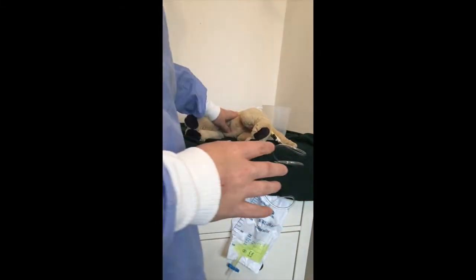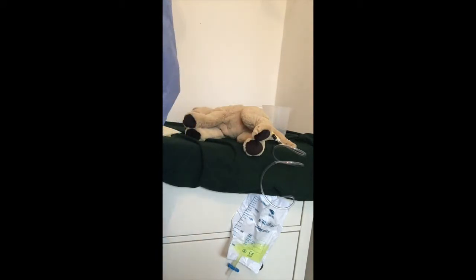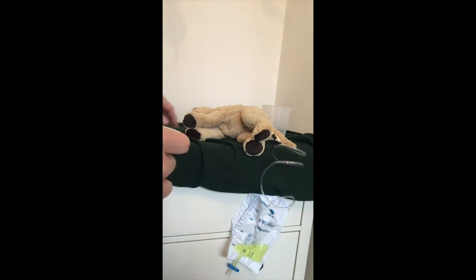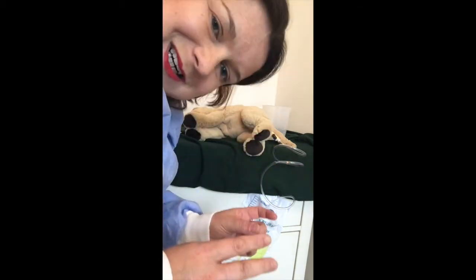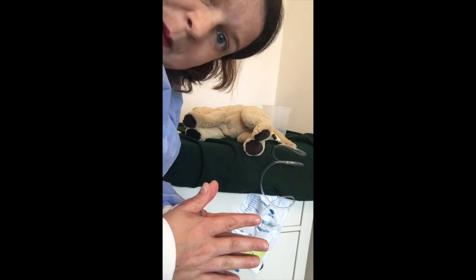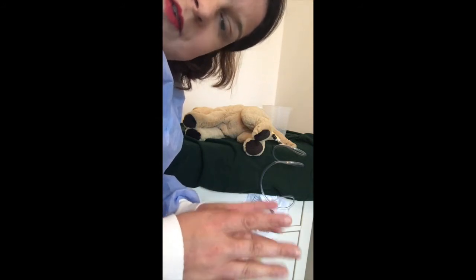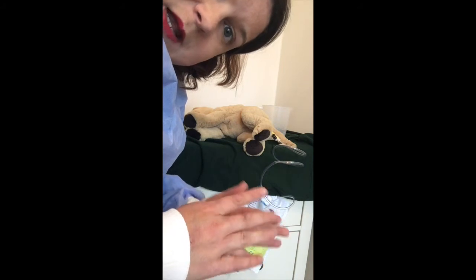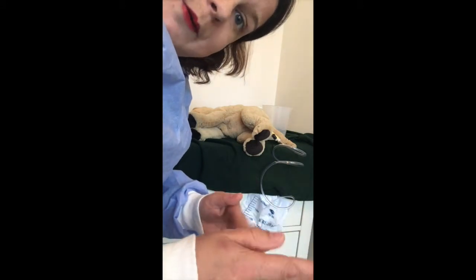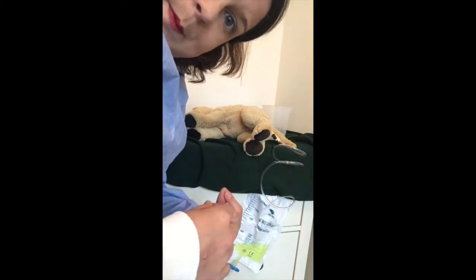I have my patient here. I know that I have to fill in a hospital sheet, and I have to do a calculation. If you want to do the calculation and the majority of the hospital sheet first, that's okay. The maths is the calculation of urine of one to two mils per kilo per hour for 24 hours — that's what it's going to be, and I'll pop a picture up at the end.